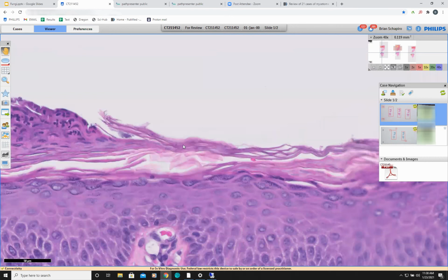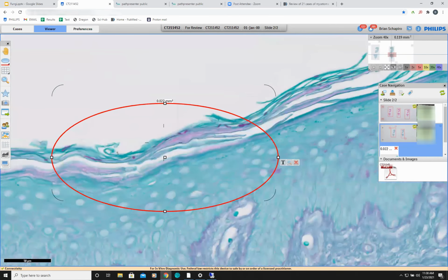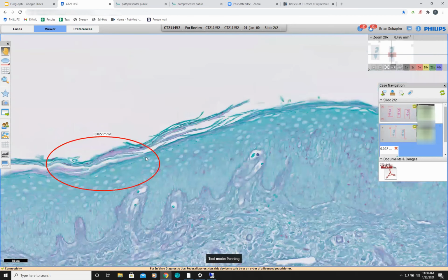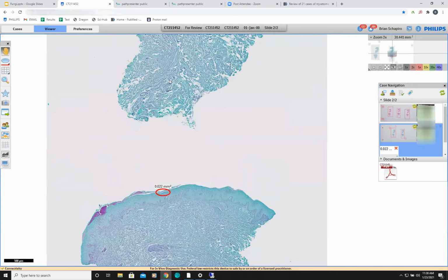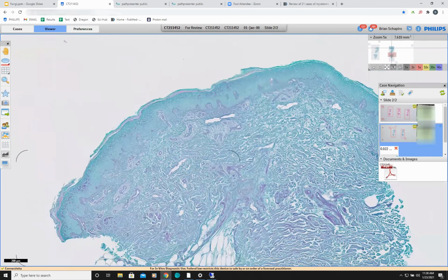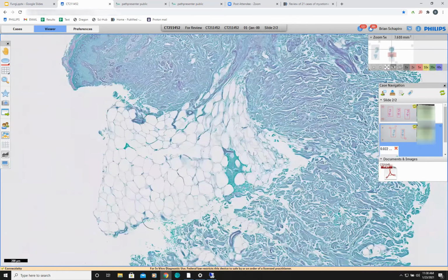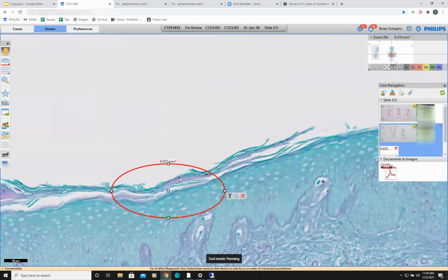It just looks like there's something going on there. So we did a PASD stain on this, and there clearly now you can see the organisms, the tinea versicolor. So they can be really subtle to find, and it's a good idea to stain these eczematous reactions if you can't see it, because the only place we found them was maybe one here, but this was a little focus of these fungal organisms.